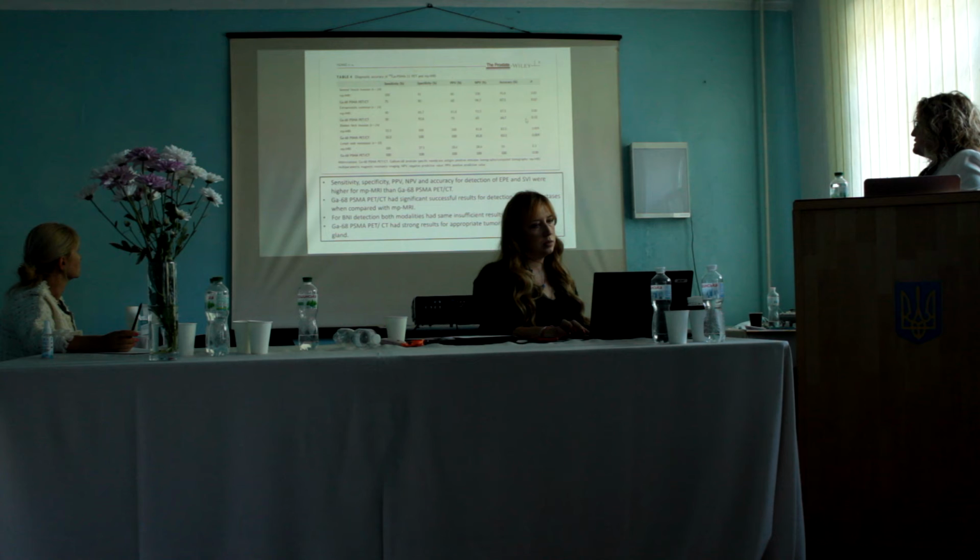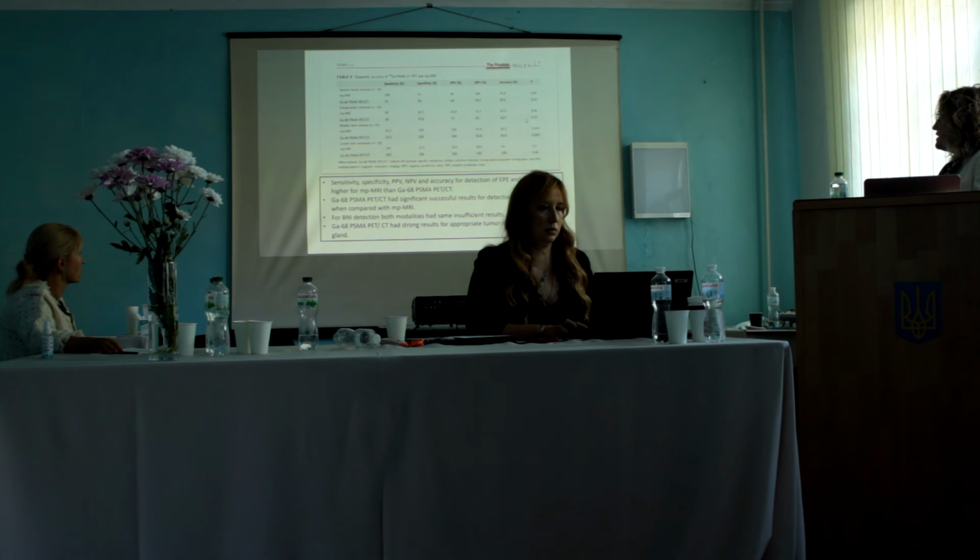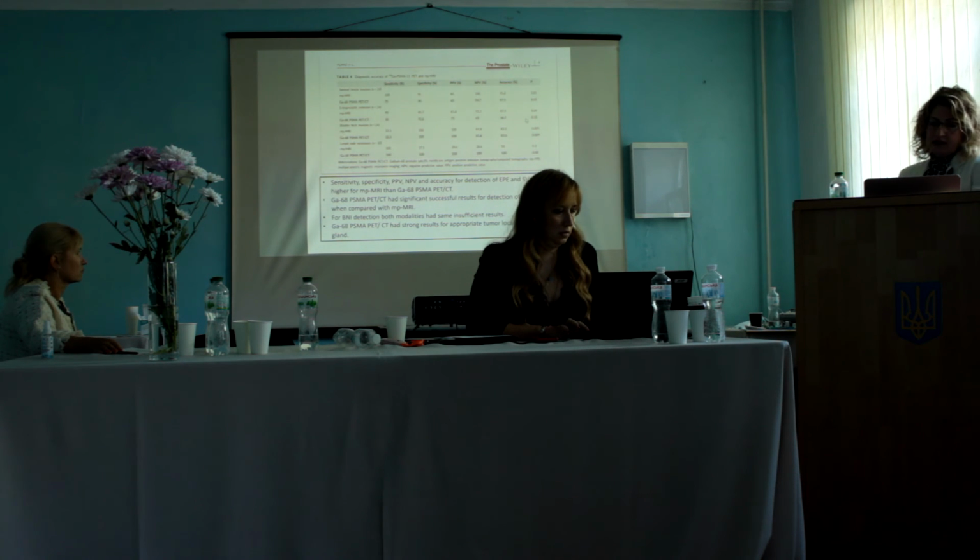In the same study, sensitivity, specificity, positive predictive value, negative predictive value, and accuracy for detection of extraprostatic extension and seminal vesicle invasion were higher for multiparametric MRI than gallium-68 PSMA, but gallium-68 PSMA had a significantly successful result for detection of lymph node metastasis compared with MRI. But with bladder neck invasion detection, both modalities had insufficient results. Gallium-68 PSMA PET had a strong result for appropriate tumor localization in the gland.